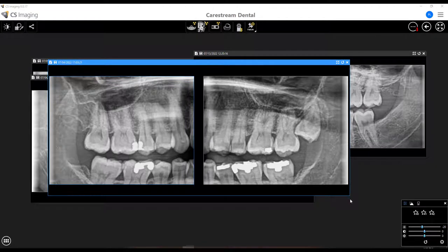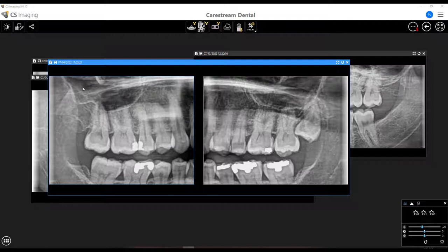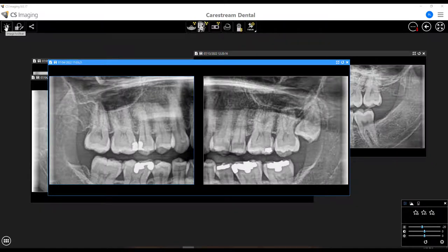So this is what I'm talking about. You can see on this bitewing taken off of the 8200 3D that we're getting much more of the upper and much less of the lower. Now in the tools — this is CSI version 8.0.17 — we can select this little toolbar and there's this button for synchronized pan for bitewing images.